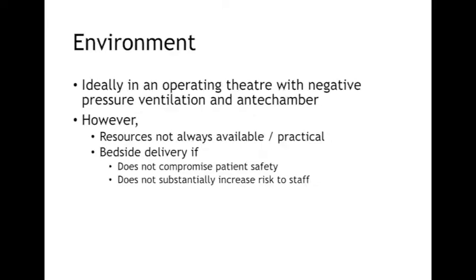Following on from this, while an operating theatre with negative pressure ventilation and an antechamber will obviously be the optimal environment, this may not always be practical. Consequently, this protocol is there to advise teams to minimise the risks both to themselves and to patients, given the resources that they may readily have at hand.